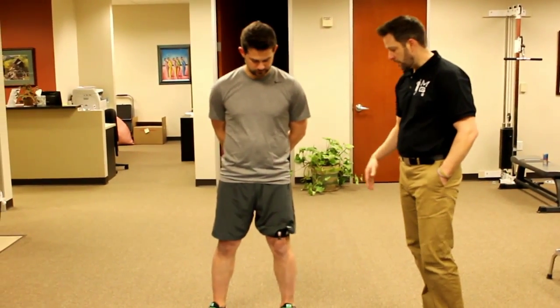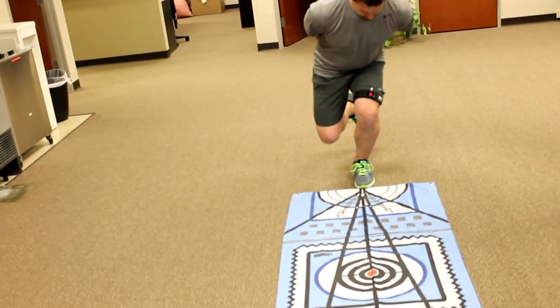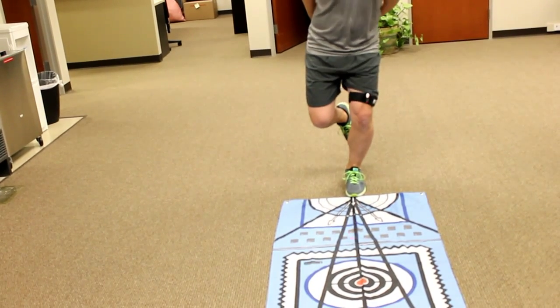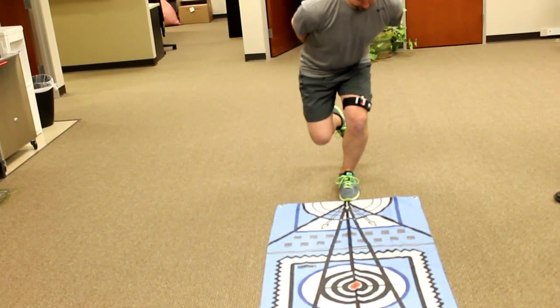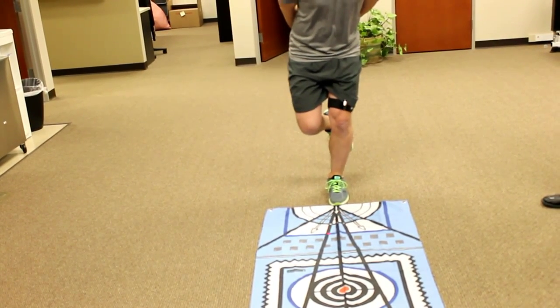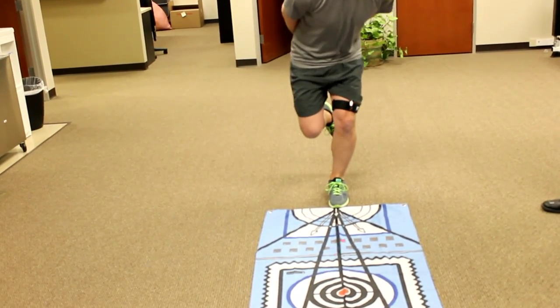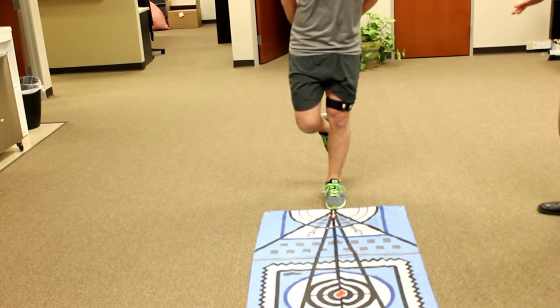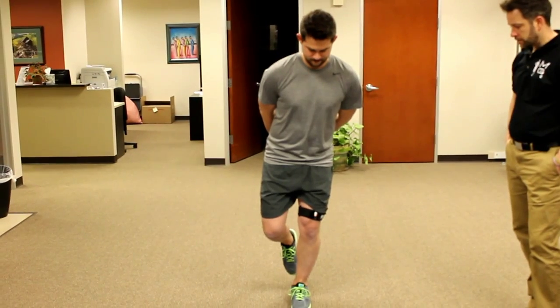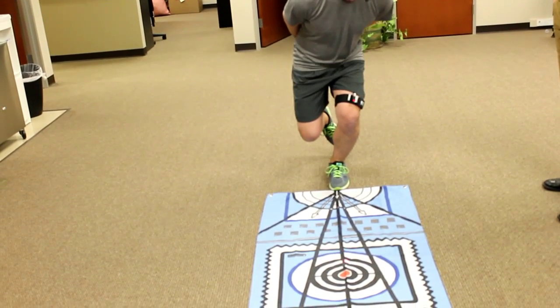Let's go back into a single leg squat and try the same thing. Now while he's changed his mechanics, he's also developed a little bit of early valgus and some proprioceptive balance challenges there. So I want you to slow down a little bit on these next couple squats. Try to keep that laser in the center line but still try to reach that out past the red dot toward the end of the flag.